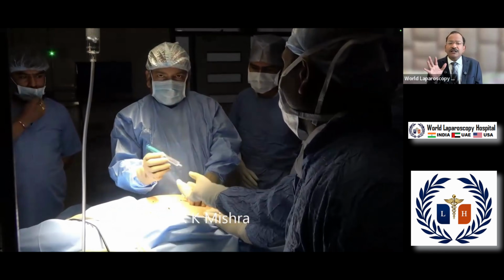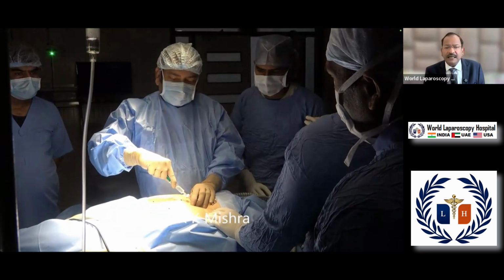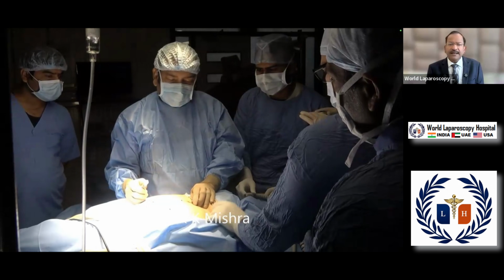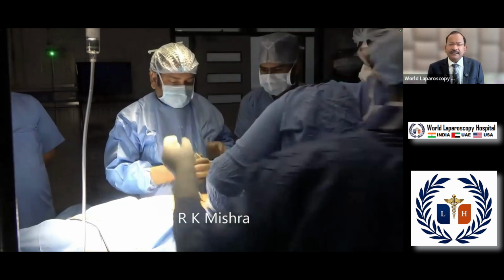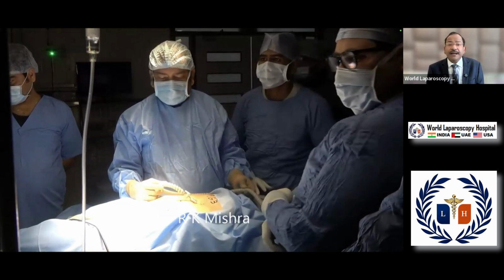You can see almost the entire Veress needle is in, because it is an obese patient and the thickness of the abdominal wall is a lot. Irrigation, suction, and after that you will do the hanging drop test. So this is the hanging drop, lift the abdomen, it is sucked in, and then you attach the insufflator, and your eye should look where? The eye should look over the quadromanometric indicator.